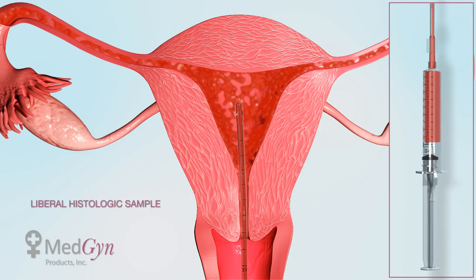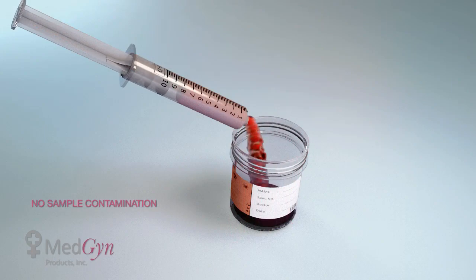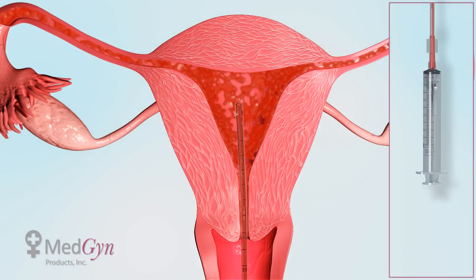The syringe is removed from the curette and the sample is dispensed for analysis. The syringe can be reattached to the curette for an additional sample.